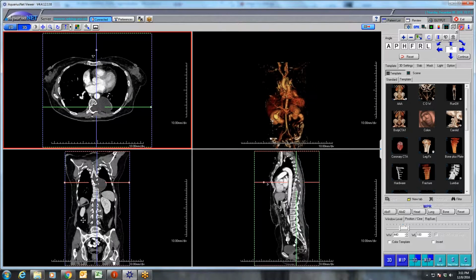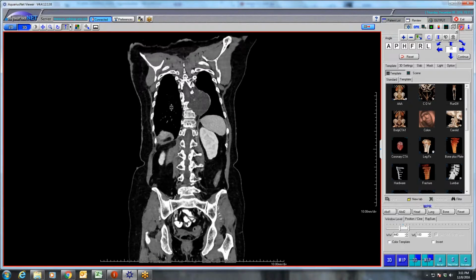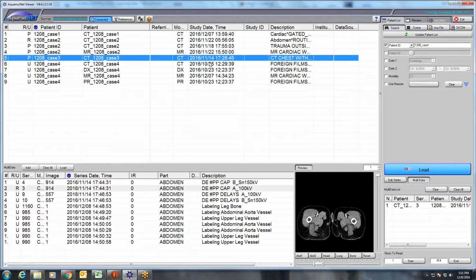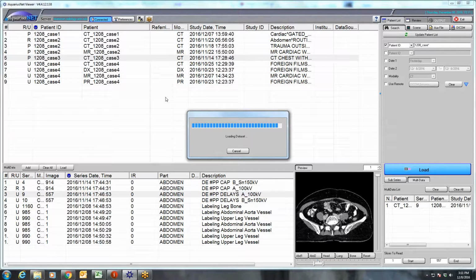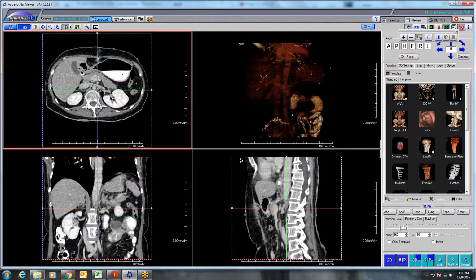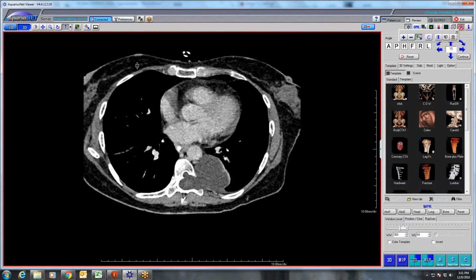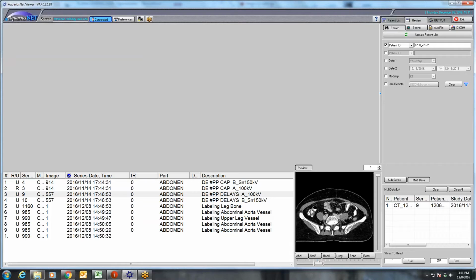So for me, this is the nicest case. Again, I've only seen this one other time. This is by far the nicest lateral thoracic meningocele I've seen, and I think only the second or third time I've seen them. I don't think there were any other dramatic findings elsewhere in the lungs to suggest NF, other than the skin lesions and this lateral thoracic meningocele.